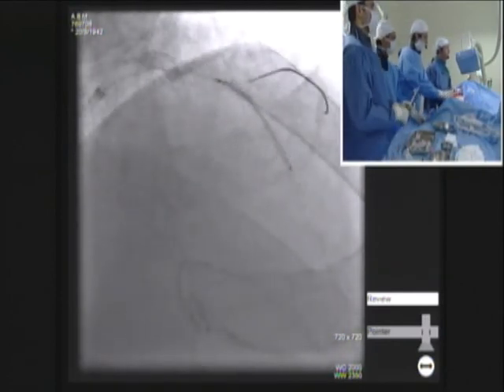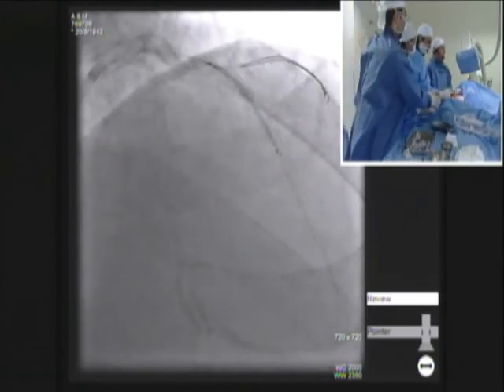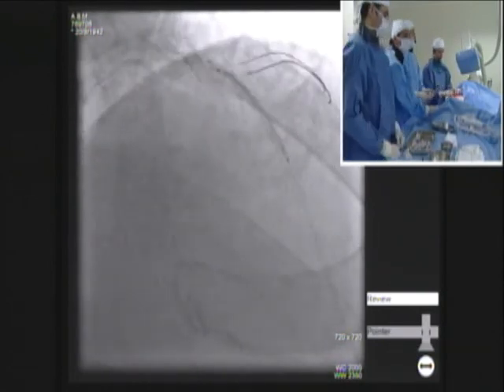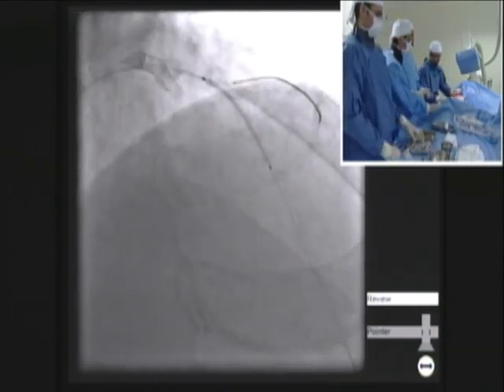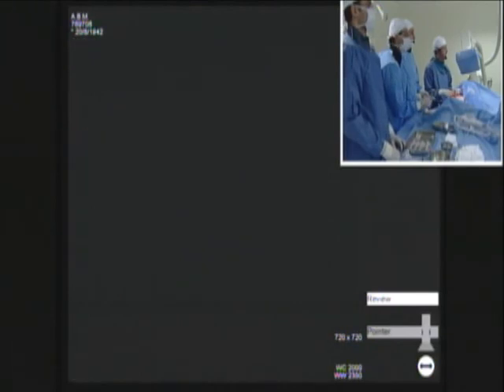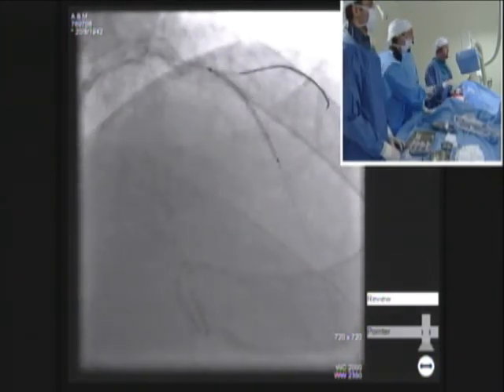What is the size of the stent length? This is a 3.0 by 28. I would pick perhaps a longer one. We are just limited in terms of length here. This is actually a Biomatrix, not a Bioflex, just due to the limitation that we have in terms of length. But I think that 28, well, we'll decide together.